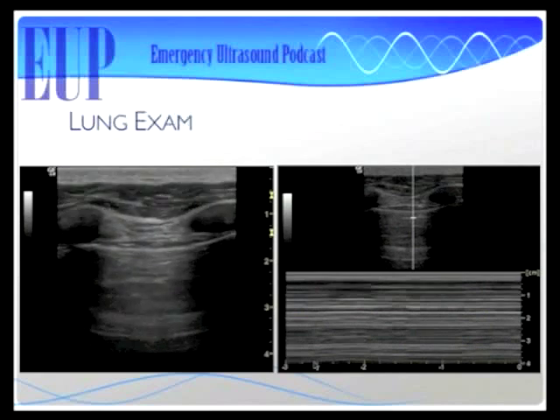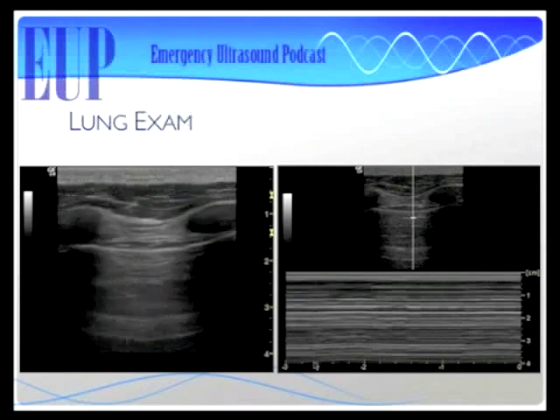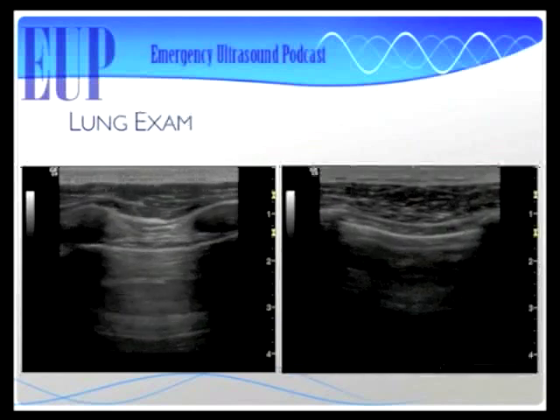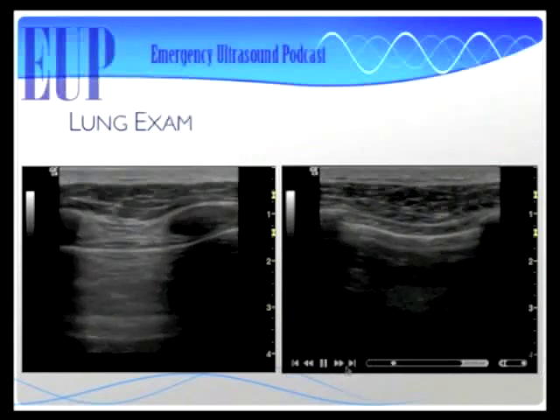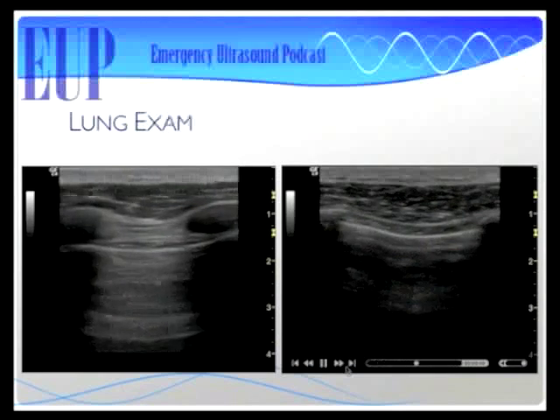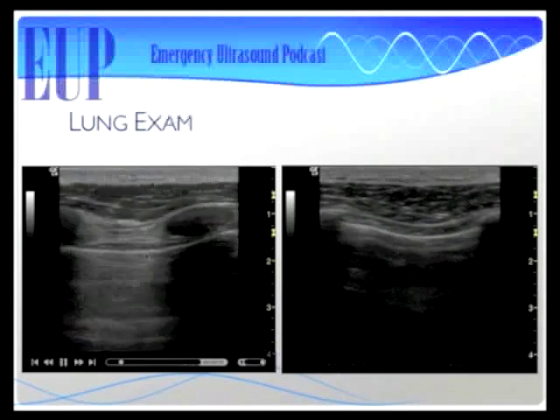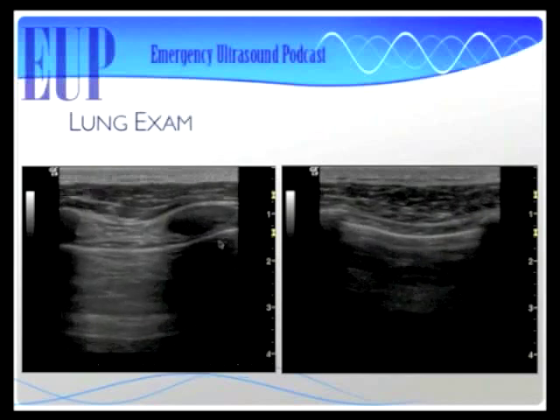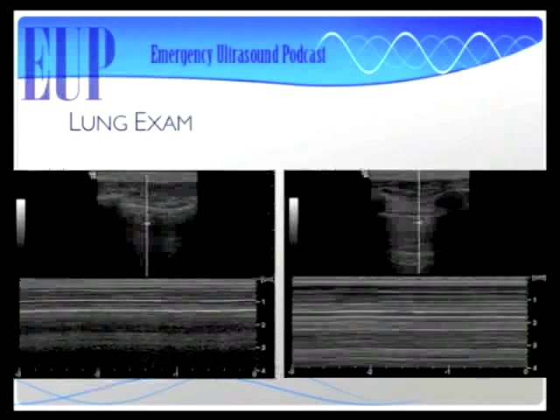That makes sense. Thanks. So here's an example of pneumothorax compared to not pneumothorax on just our B mode imaging. So which one there is the pneumothorax, Matt? The one without the shimmering. Excellent. The one on the left. Perfect. Here's an example of the two, comparing the sandy beach sign to the stratosphere sign. And you can see the sandy beach is on the left, so no pneumothorax there, where the stratosphere is on the right, so there's evidence of pneumothorax there.